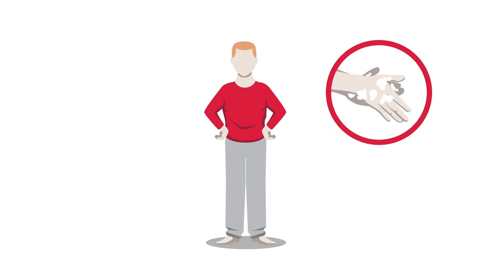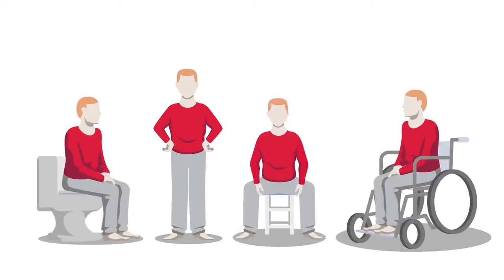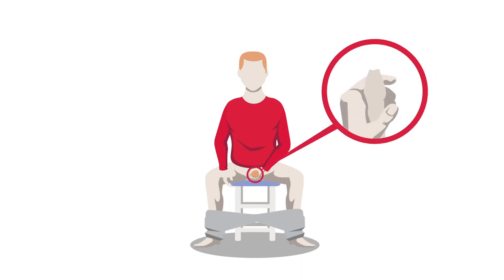Wash your hands. Find a comfortable position. Some men prefer to stand for the procedure, but it can be done just as easily in the sitting position. Manipulate your clothing to access your genitalia. Lift your penis using your non-dominant hand and retract your foreskin, unless circumcised. Clean your glans penis and around your urethral opening as instructed by your healthcare professional or IFU.